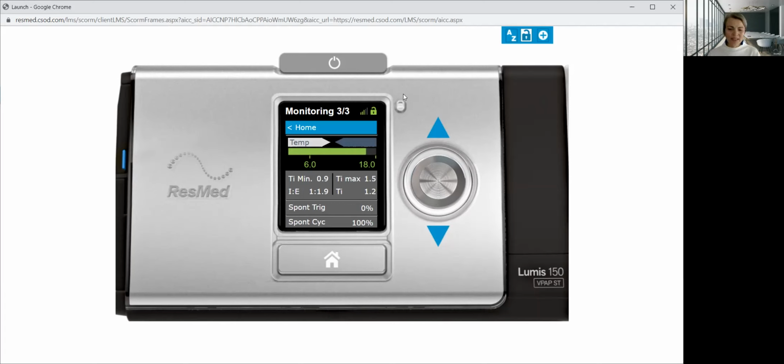I hope I was able to give you some insights about a non-invasive ventilator, how to use it, and how easy it is to use. I hope I managed to provide useful information on using the device, making settings and applying them in practice.